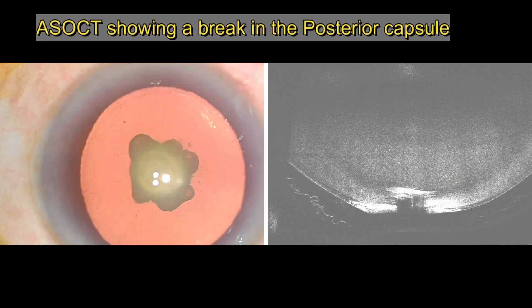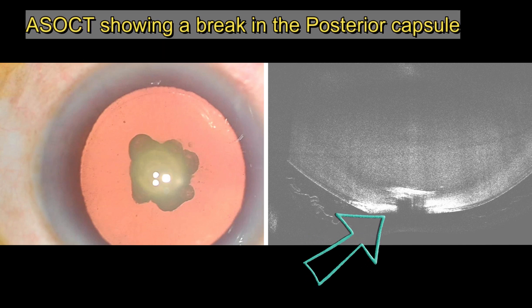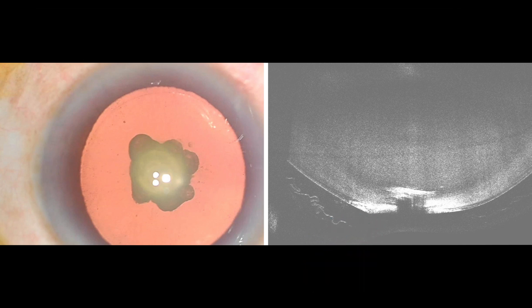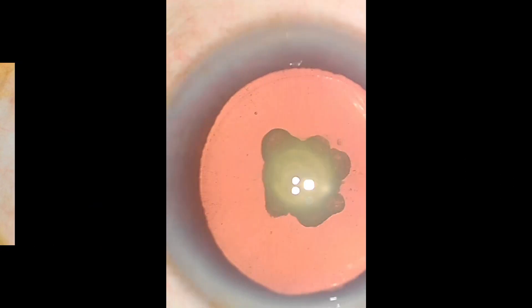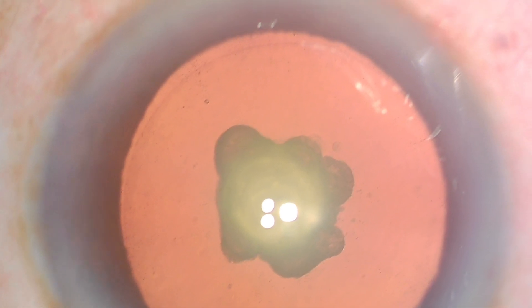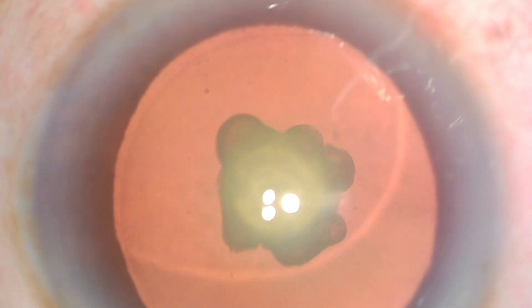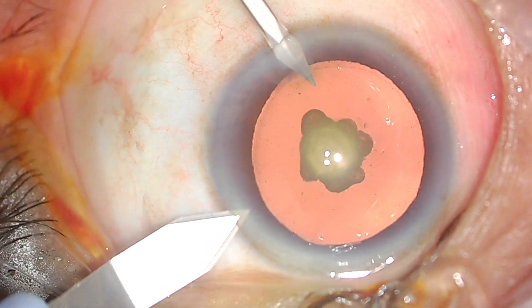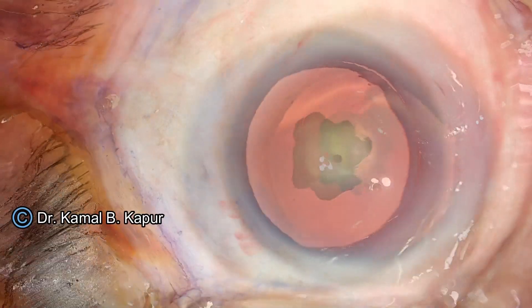This is a case of posterior polar cataract with a pre-existing posterior capsule opening. On detailed examination and an ASOCT, it is evident that there is a break in the posterior capsule. On detailed evaluation, we can see these dark rings in the posterior polar cataract, and this is enough evidence. Sometimes these rings may show up as rings of red glow in the posterior polar cataract.